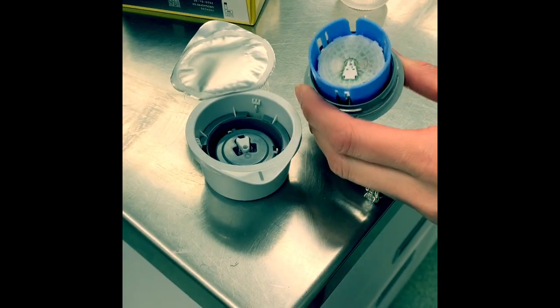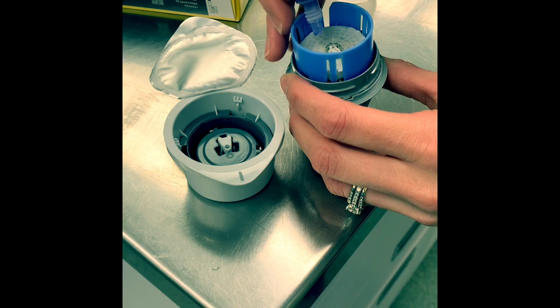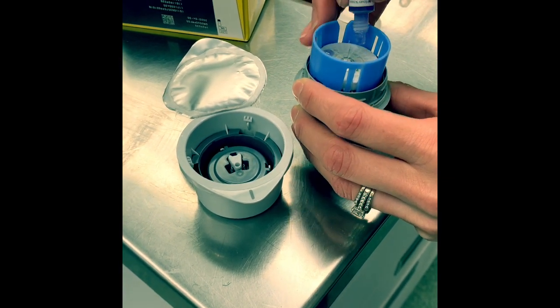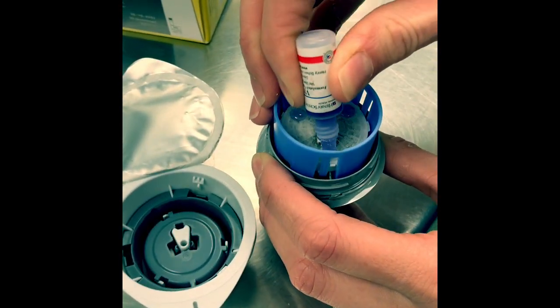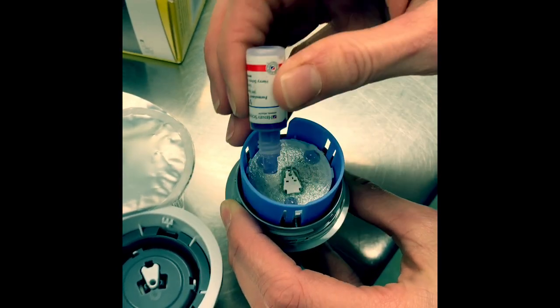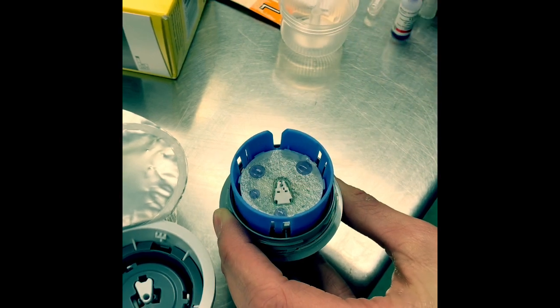We've got our sensor and we're going to put a little bit of glue around this area to help it stay in place once we put it on Mick's skin. We just have to be careful — we don't want to put tons of glue, but we obviously want this thing to stay put. I'm probably being a little extra with the glue, but oh well.